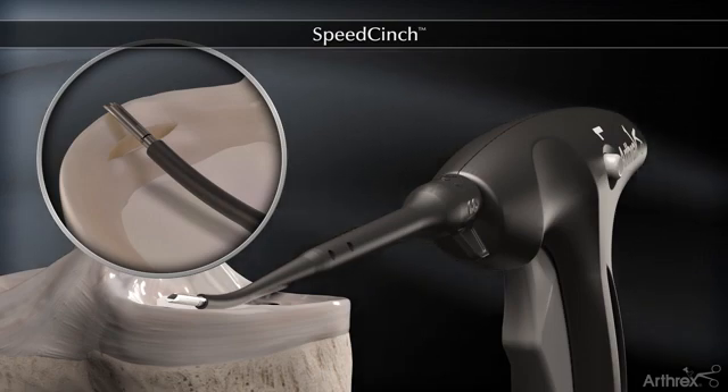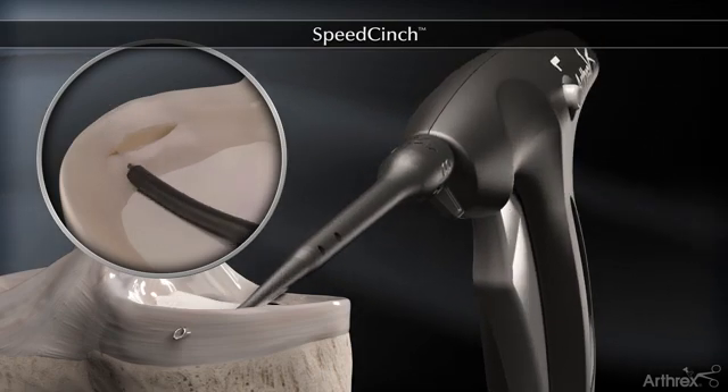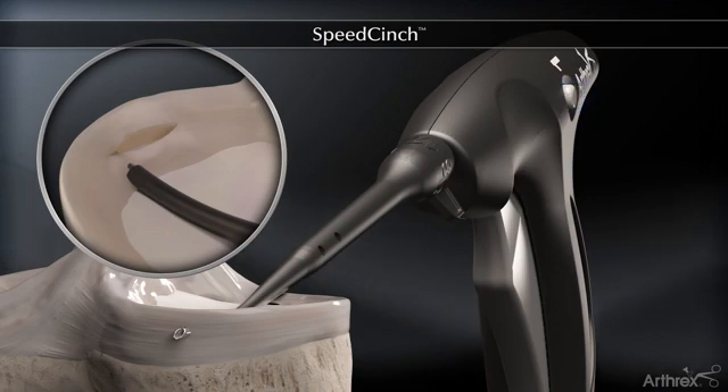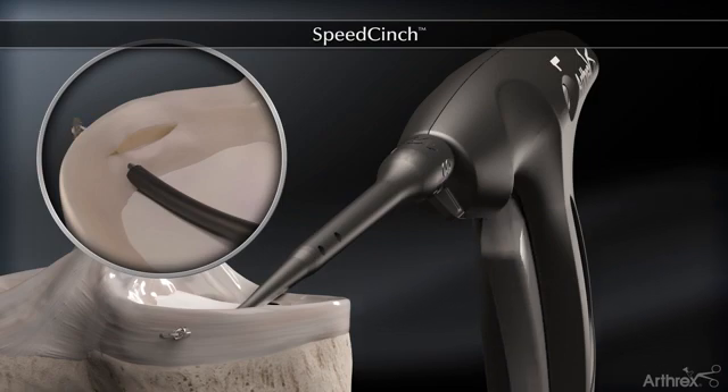Advance the needle through the meniscus by pushing the entire handpiece forward until the desired depth is reached. Engage the first implant by depressing button number one completely. Actuate the trigger to the click to deploy implant number one.